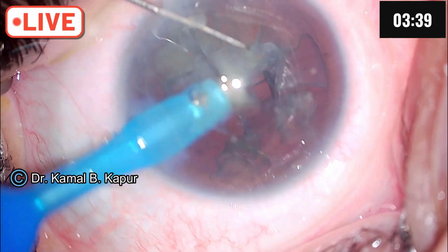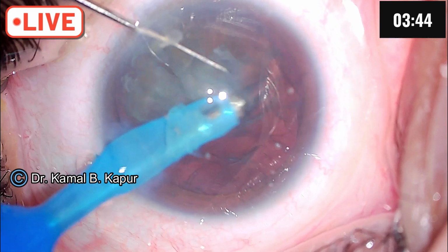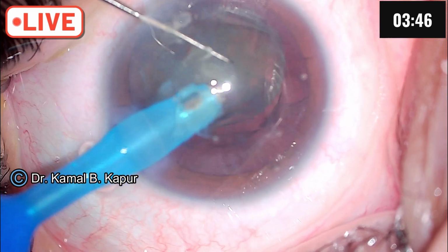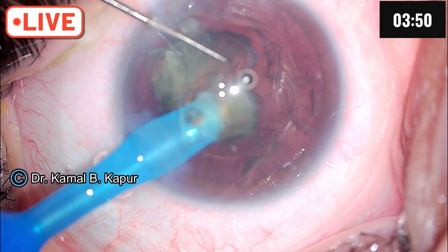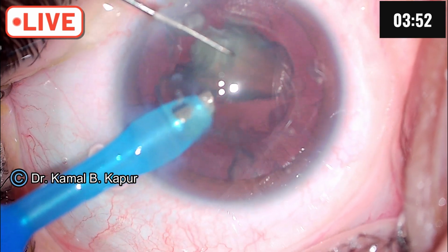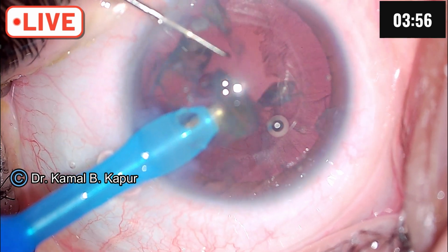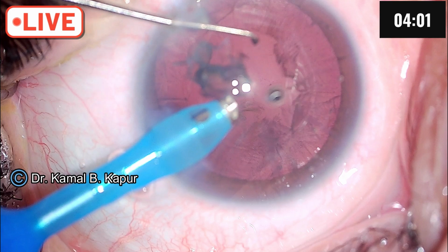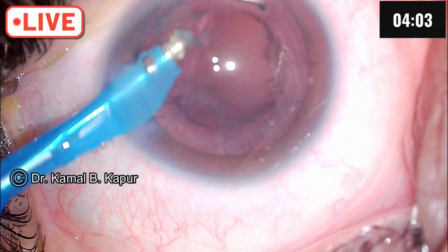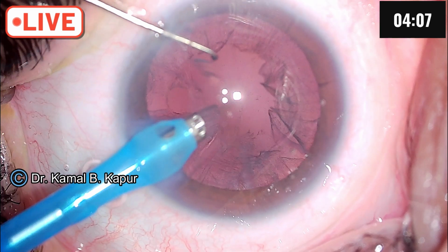Also, most of the movements in the main wound are linear, forward and backwards. We should avoid lateral movements because they can also cause stretching of the corneal cuts. So, 2-3 things to remember: stable anterior chamber, least amount of movements in the main wound, dipping of the side port off and on whenever you feel that the IOP is going up. You might see some chamber fluctuations because of the lower bottle height. And there you are, the case is over.